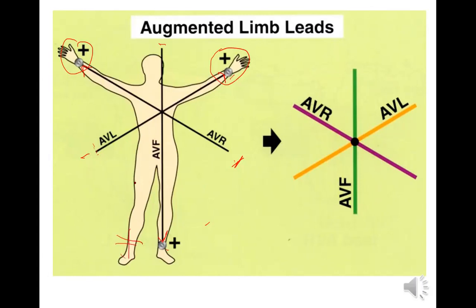Can you think of it as, for AVR, AVF or AVL, the right arm will not be negative? Yeah, for these augmented leads, that makes sense. The R is positive, the L is positive. So you draw the arrows, the plus signs, and have fun with it. And then you could do lead 2 coming in here, lead 1 here, and lead 3 here. And there's 30 degrees between these.